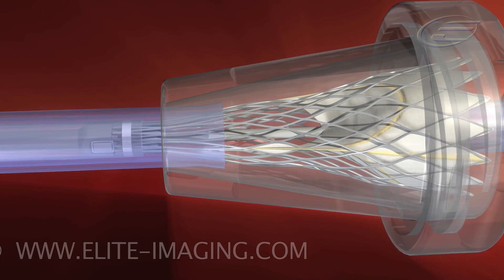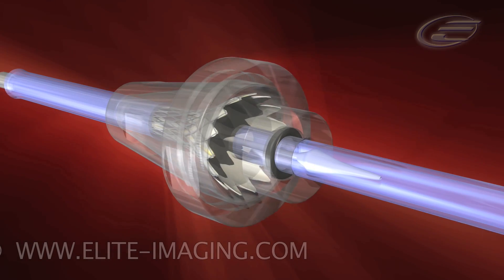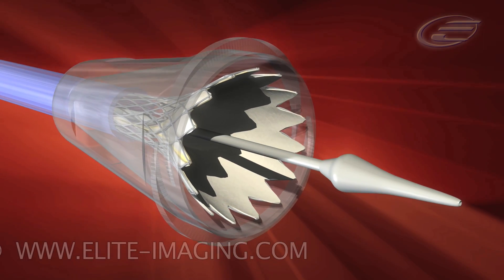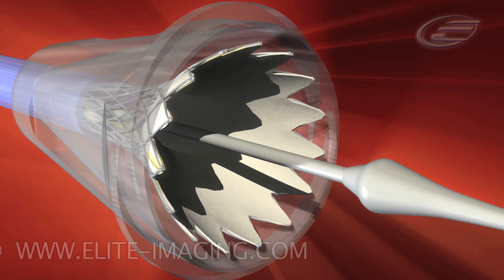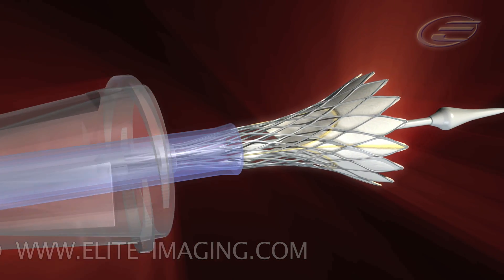Simultaneously advance the tapered outflow tube and catheter sheath over the frame. Remove the outflow cap and inflow tube. Slide the outflow cone over the outflow tube and catheter.